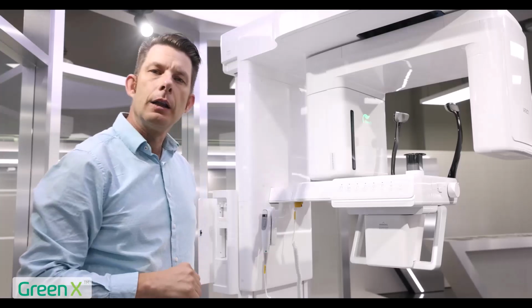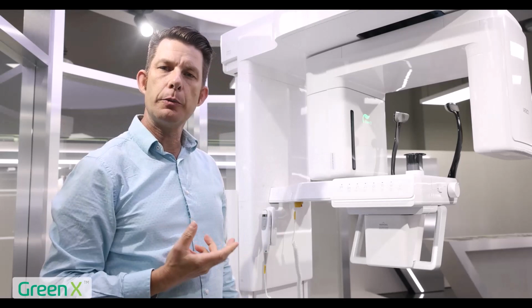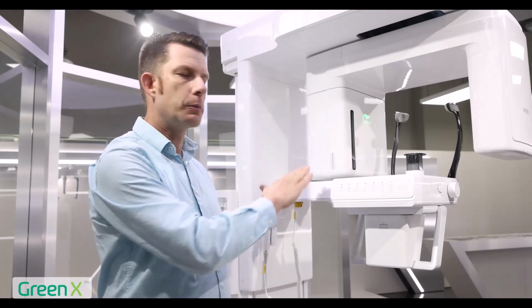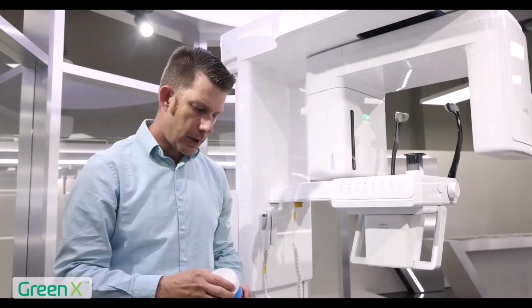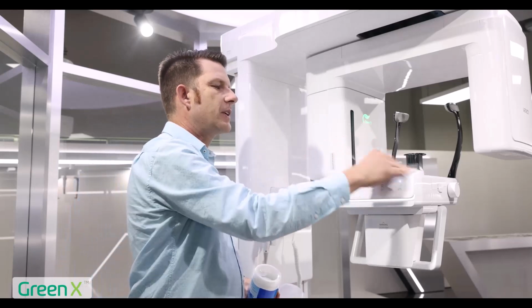All right, let's go ahead and look at cleaning and care for the device. With cleaning and care, you want to use a hydrogen peroxide based wipe. We do not want to spray on the device, but just use a hydrogen peroxide based wipe to wipe off the areas. So I've got my hydrogen peroxide based wipes here. We're going to wipe the device down.